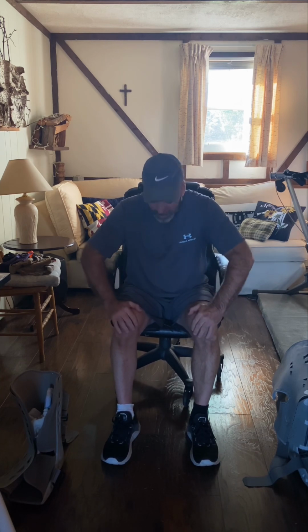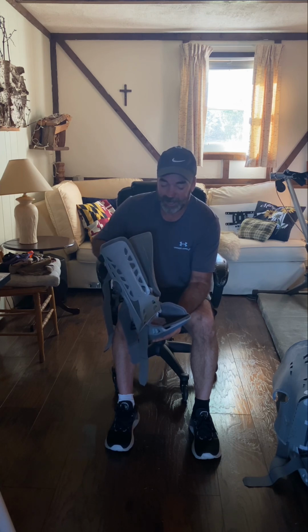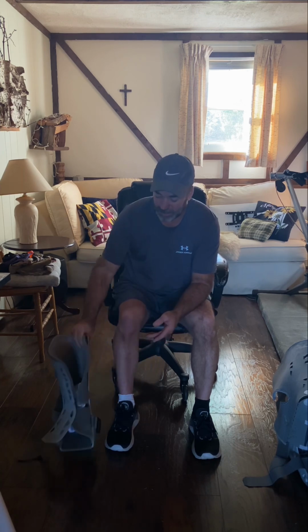As you see, I'm in my regular shoes, and I don't necessarily recommend this for everyone. It all depends, like I said, on your surgeon, the protocol, the physical therapy, your personal injury, your personal experience and everything. Everybody's different. But for me, I have been transitioning from the boot, the wonderful boot, which is our protection, and this is very helpful because this keeps your foot at neutral.